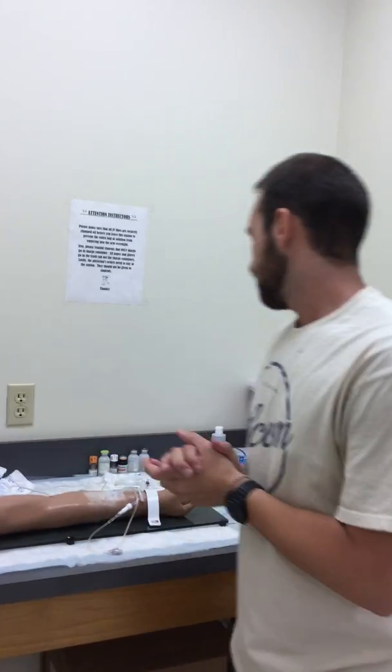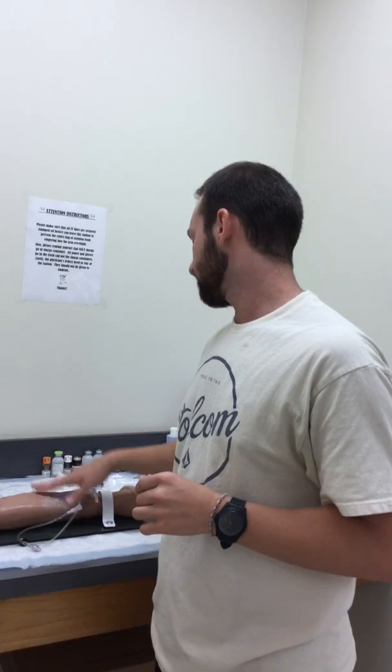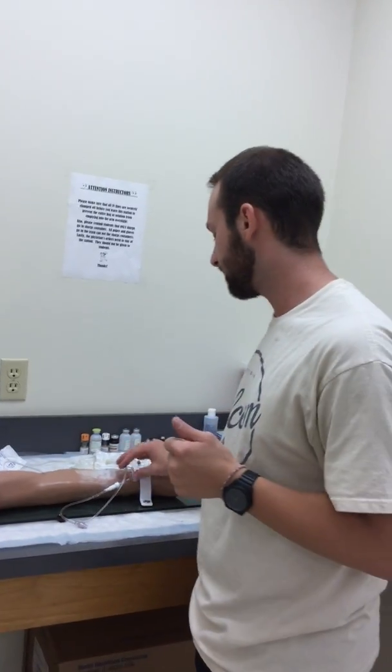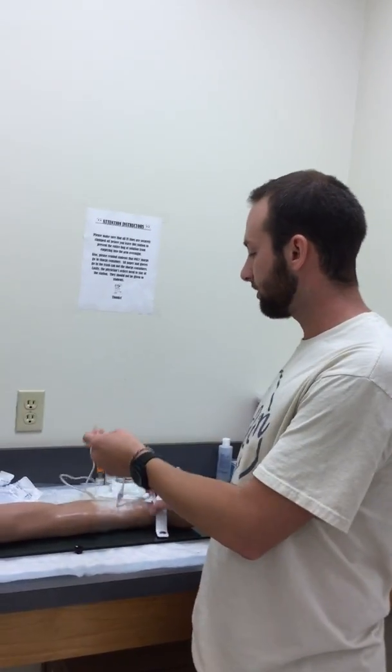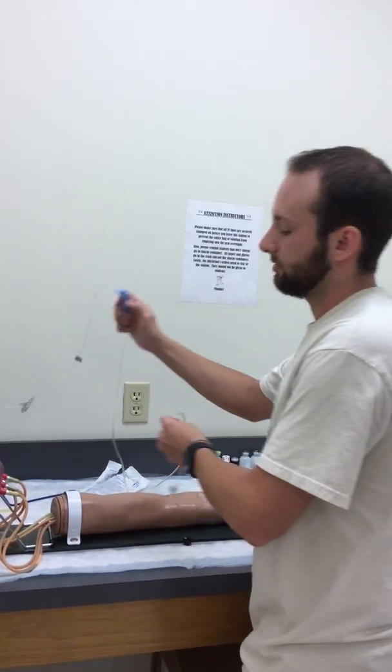Okay, then after that is good, we're going to want to make sure that this is still flowing properly, and there's no swelling, no infiltration, no irritation, and it's unclamped, none of these are clamped, and this is set back at whatever the doctor had ordered at first.